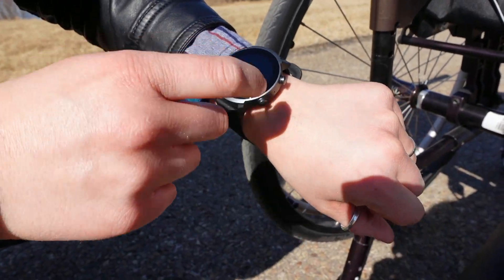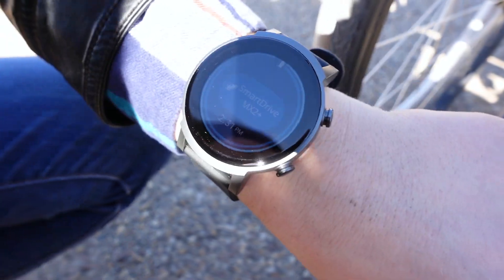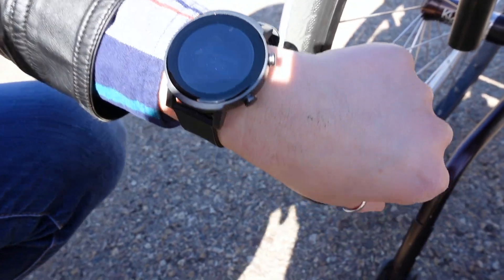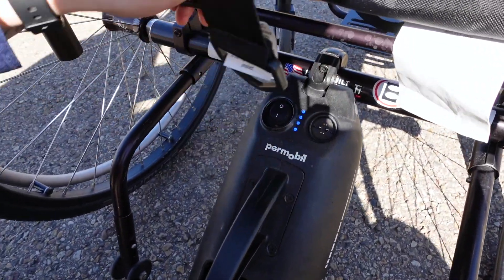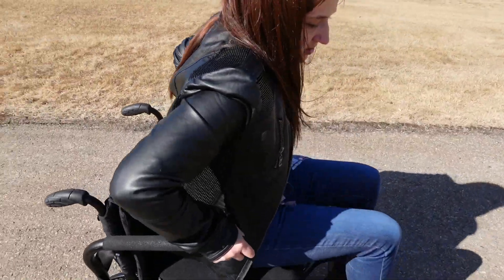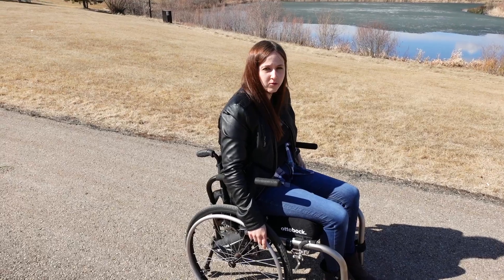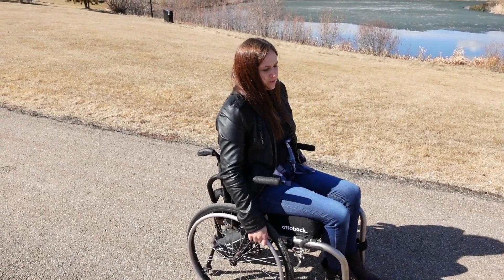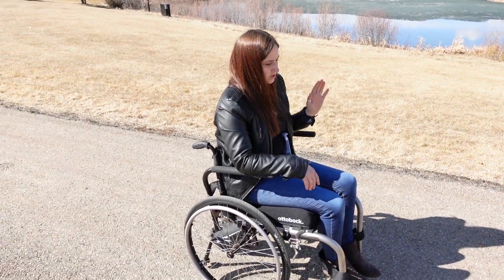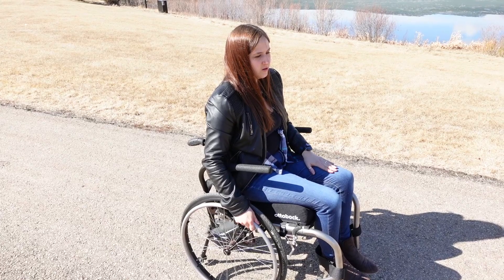This is good with the technology option. It'll say SmartDrive on the watch. So I'm going to get back in there just so you can see — we've disconnected the dial because we're not using the dial anymore. Now let's say you just had your watch. So a few safety things you should consider when using the watch because it is a little more intimidating than the dial. Typically, whichever wrist your watch is on, you tap twice to get it going, and tap once to lock in the speed that you want. We'll give a demonstration.